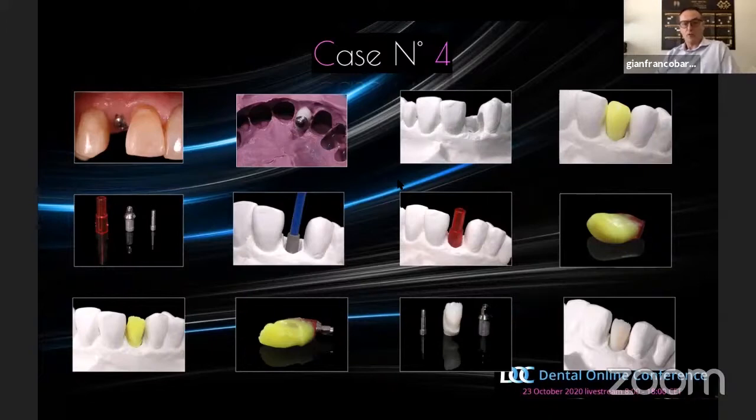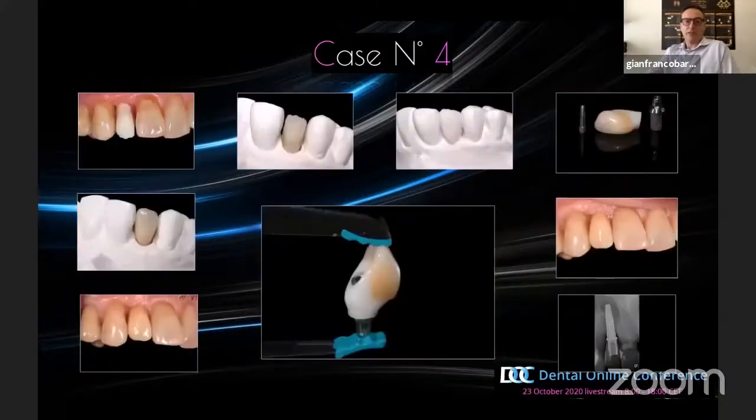In this case it was micro-layering ceramics. We layered only the enamel, just to give more structure and resistance, and it was chosen to do it totally in lithium silicate. We made the test in the mouth, then layered with all the effects, and then cemented it.